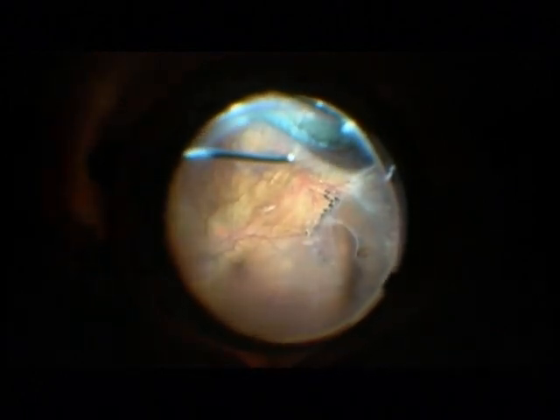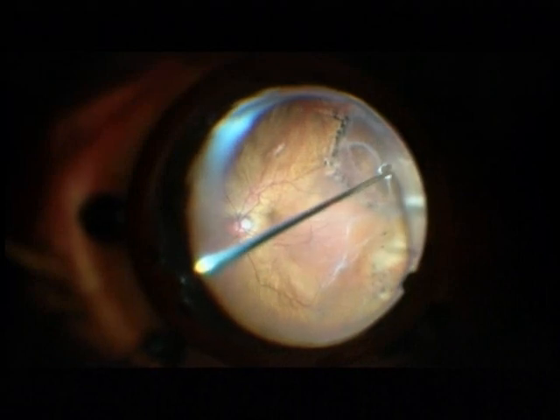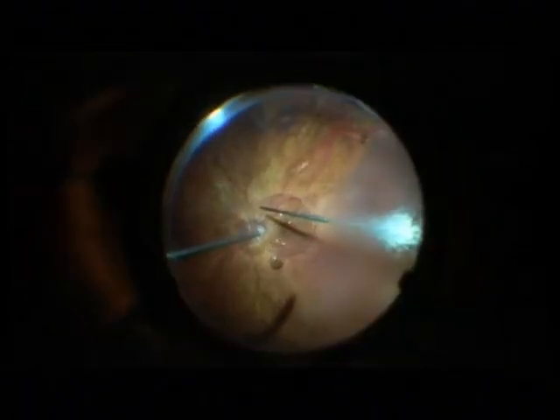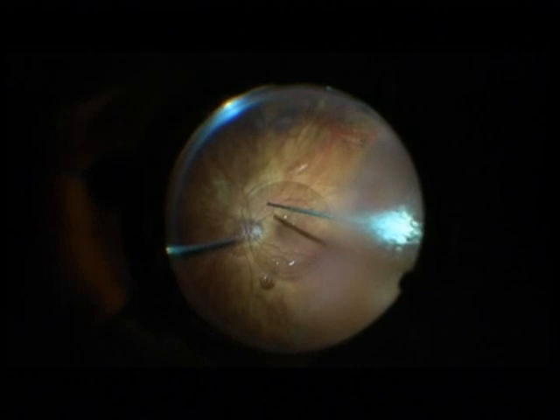I prefer 27 gauge vitrectomy for children and for long eyes for the same reason — because I don't like sutures. There is much less leakage and you have a tight globe on the first postoperative day. I am ejecting now perfluorocarbon.